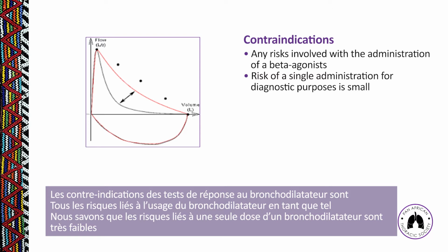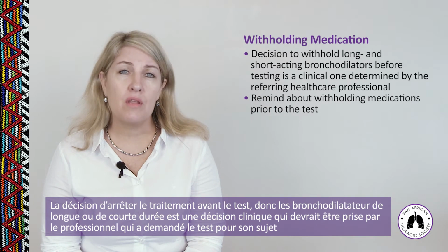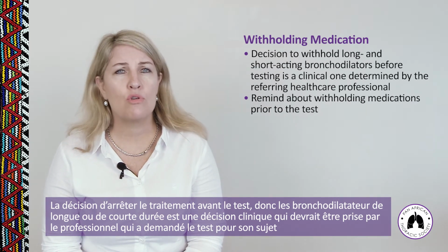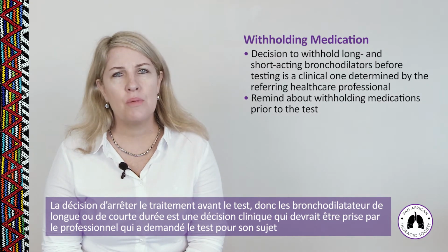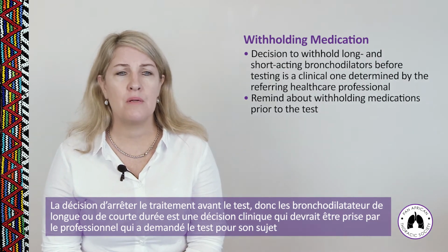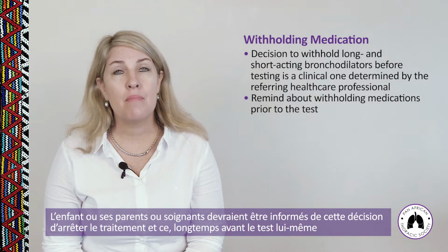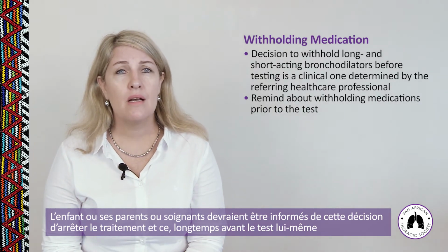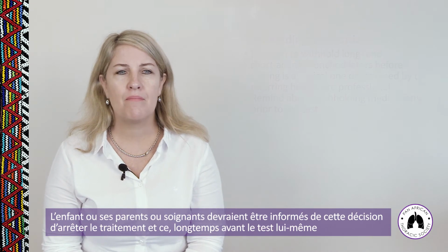So we know that the risk of a single dose of a bronchodilator is very small. The decision to withhold medication before the test, in other words, long-acting or short-acting bronchodilators, is a clinical one and should be determined by the person who is actually ordering the test. The child or child's parent or caregiver should be reminded about the withholding of medications, and those instructions must definitely be given way before the test.